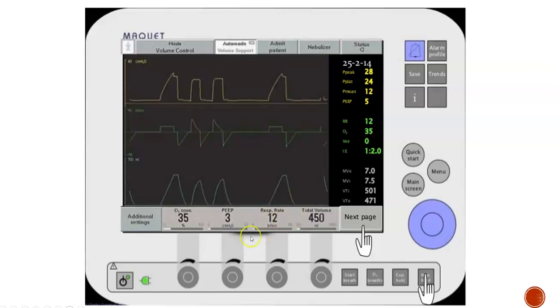The respiratory rate is 12, and then the tidal volume is set at 450. Remember I said 350 to about 500 is about what I've seen. I may have seen 550 once, but I've never seen anything over 500 and something. I've never seen a 600. Doesn't mean that it doesn't exist, but like I said, the patient that I had that was either 500 or 550 was almost a 600-pound patient. So even patients that big, that's still the highest that I've ever seen.